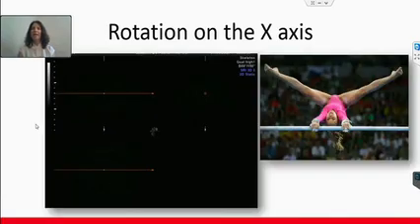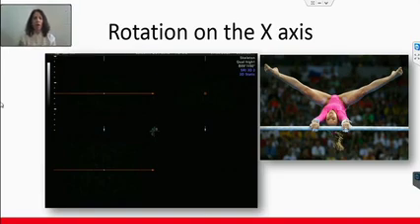Now the x-axis, you can think of a gymnast swinging on a bar. If we look at her in front with the A plane, we can see the axial and coronal planes when she rotates. And also if you look from below, from the floor, or from above, we will see the axial or coronal plane. But if we look from the B plane, from the side, then we see only her sagittal plane rotating clockwise or anti-clockwise.